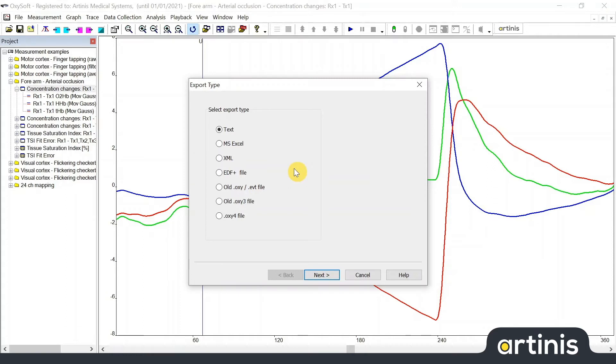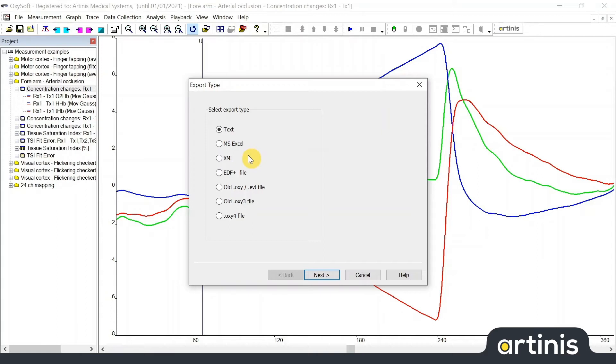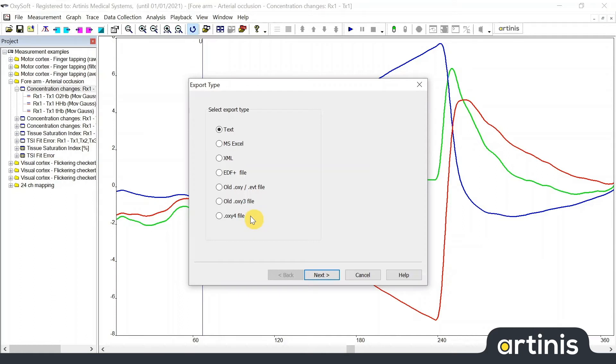In this window you can select the desired export format. The available formats are text, Microsoft Excel, note that this is only possible if Microsoft Excel is installed, XML, European Data Format Plus, an old oxy file, an old oxy3 file both can be convenient when reopening files in old Artimis software or you can export to a oxy4 file.